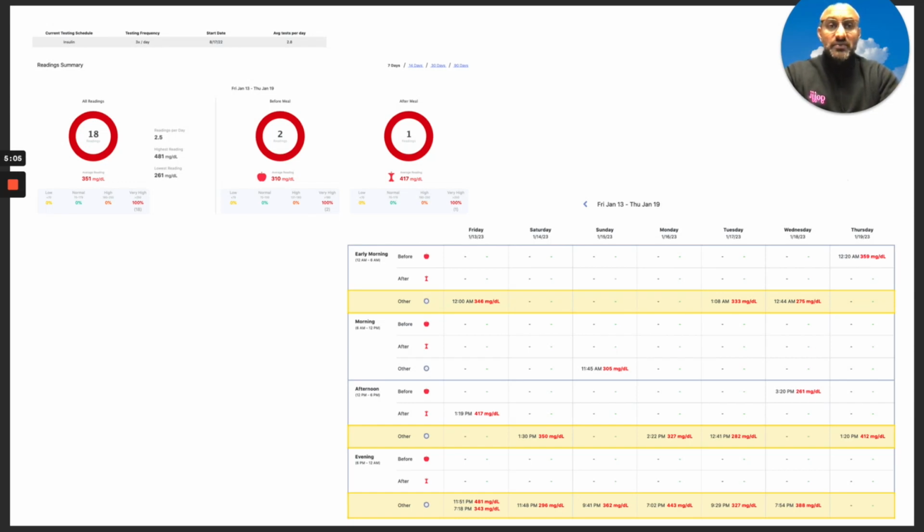You even know if it's before or after a meal. And also you have a time study in terms of understanding what particular day, also what time of the day. This will help you narrow in. And this is the X factor, understanding when a patient is not doing well and what particular patient-specific intervention you want to conduct.